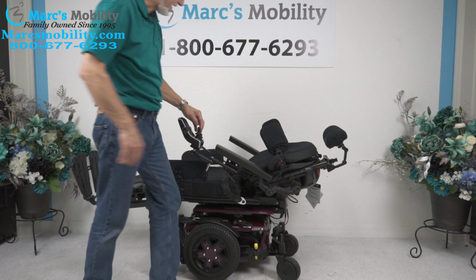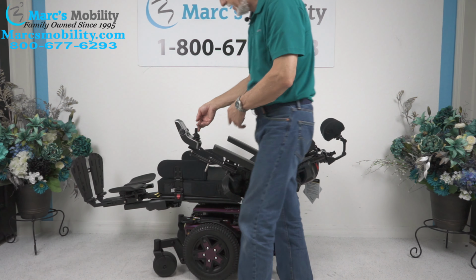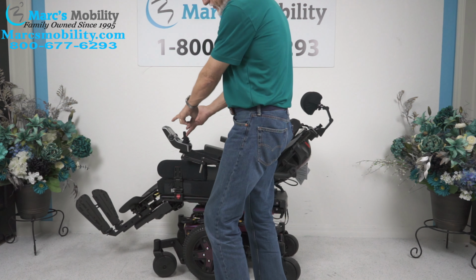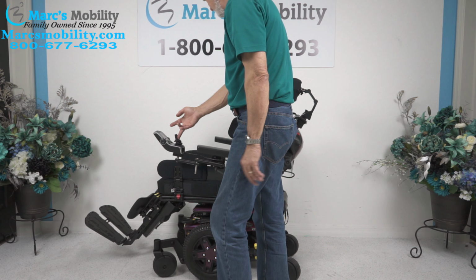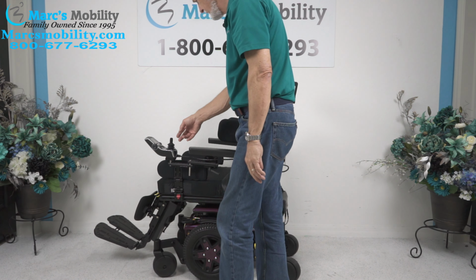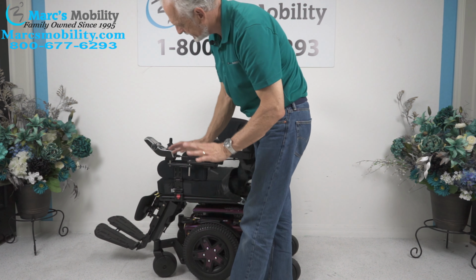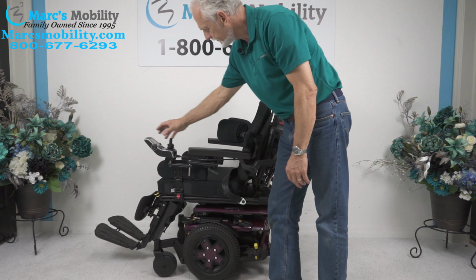I'm going to bring the seat back up. As a matter of fact, I'm going to do 2 functions at once. Now I'm going to bring the seat up, and I'm going to bring the legs down and the seat up at the same time. You can do 2 functions at once on here. Okay, if you're outside, leave your legs out a little bit so you have more room. You do not want to jam these legs on the sidewalk. If you do that, it's going to be expensive to fix.